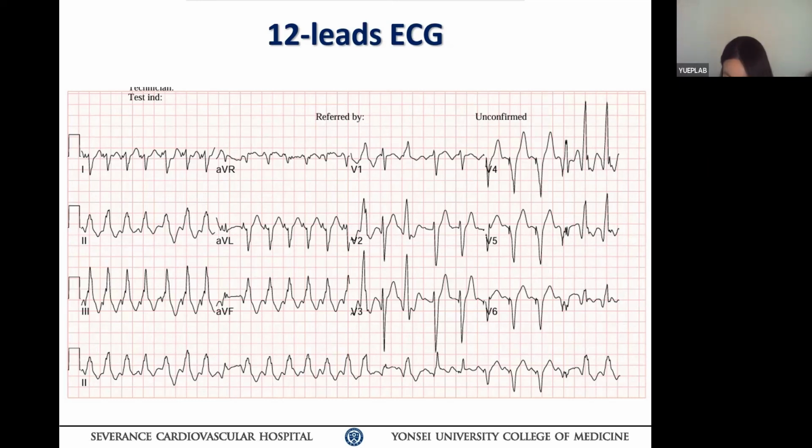Here the situation is slightly different because there's a device and pacing is taking place. There can be a fusion between the paced and the ventricular beat and make it narrow. But otherwise, that's correct. If there is no device and you have a wide QRS tachycardia, and in between it becomes narrow, there cannot be any mechanism except a VT beat. That's well known. Many of our mentors taught many people many years ago. Okay, your comment is welcome. Okay, let's go. Next slide.